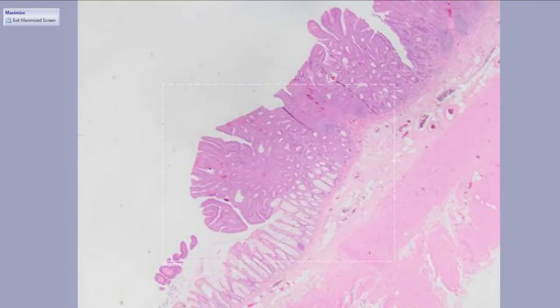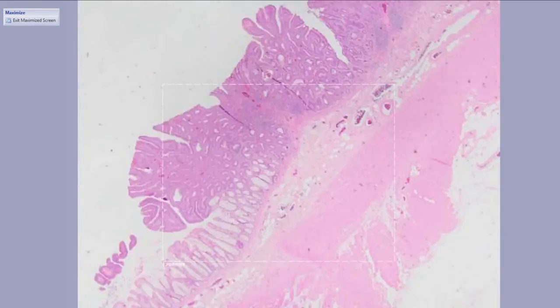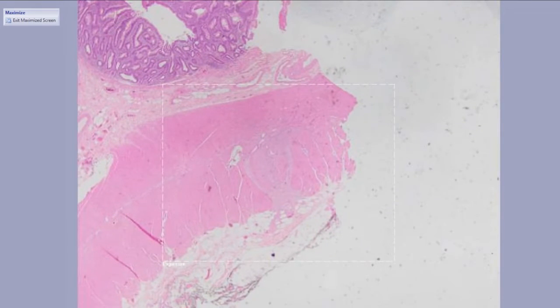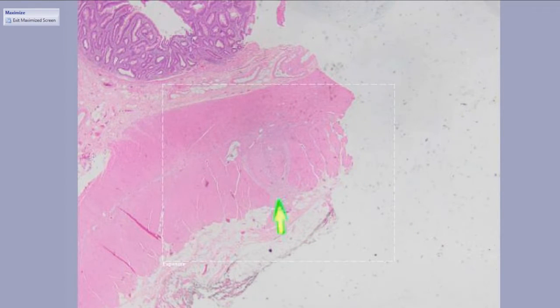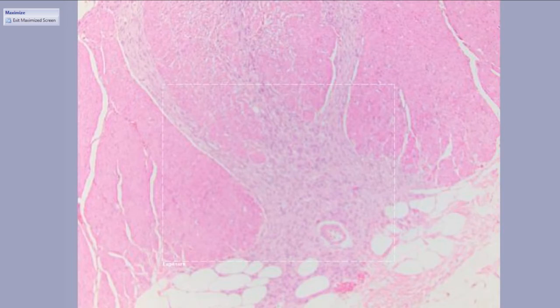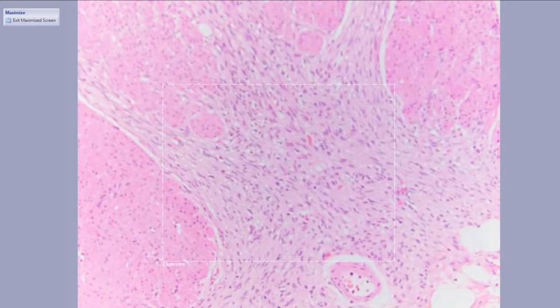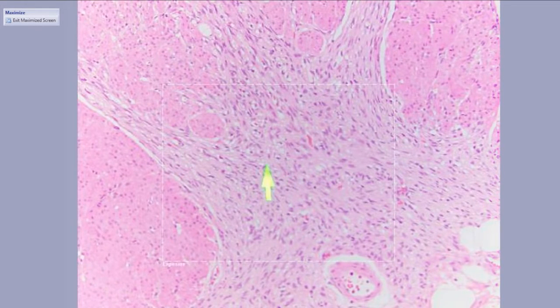All right, so this patient got a colon resection for this TVA, and then they also had a little incidental finding, which is what I'm here to show you. There's this funny little nodule down in the muscularis propria, and I think this is rectal, so we'll say perirectal fat. Going on higher power, it's clearly not rounded, well circumscribed. It's infiltrating throughout, but it has that vacuolar artifact that I mentioned in GISTs.